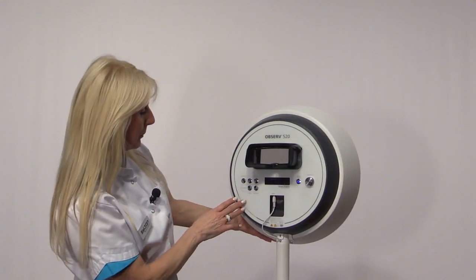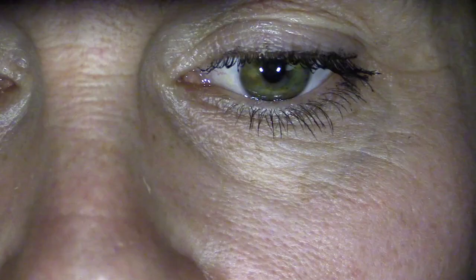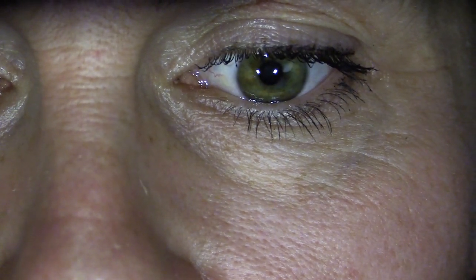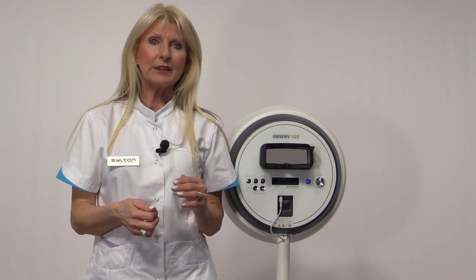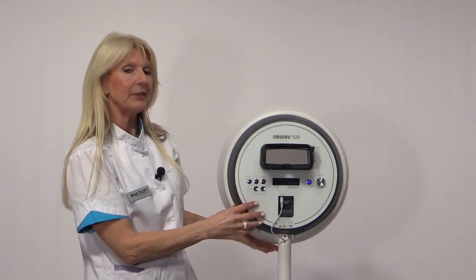Okay, now for the parallel mode, which is this one here. This mode makes the textures of the skin more visible. The 3 lights illuminate the skin in a directional way. This focused light reflects on the fine surface textures of the skin, making even the finest details of the skin's microrelief visible.